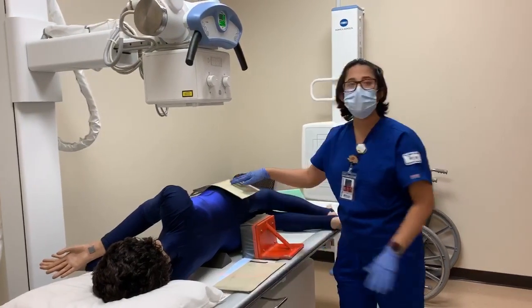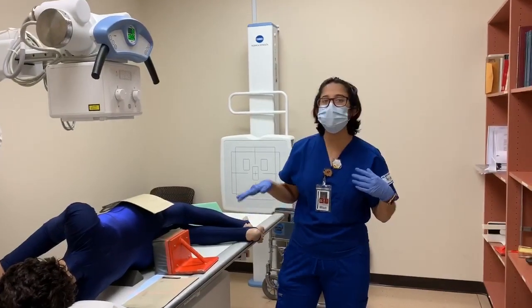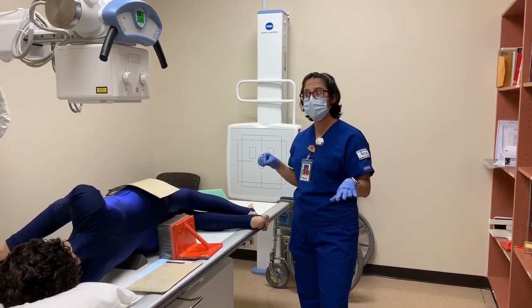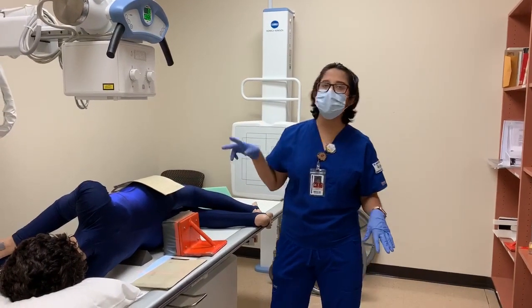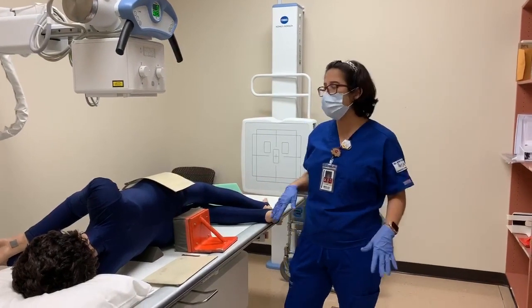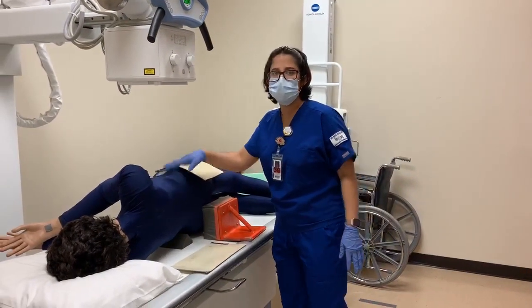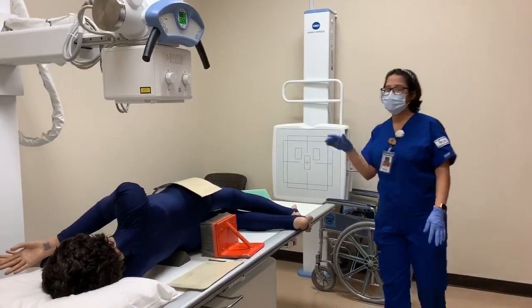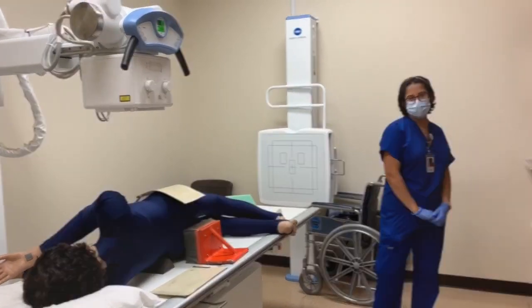At this point, I'm going to instruct them that we're using the orthostatic breathing technique. So we're going to do a low mA, hold it for 2 to 3 seconds on the exposure, and they're just going to breathe in and out to help blur that out. So we practice it once with them. I'm going to step away, breathe them, and then expose.